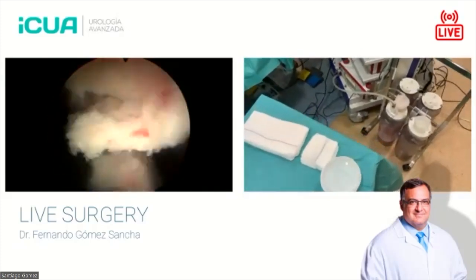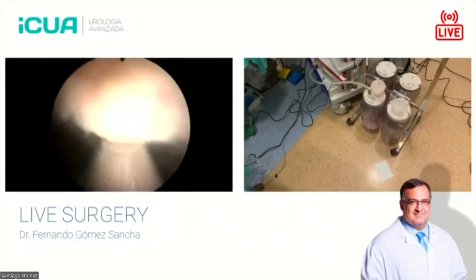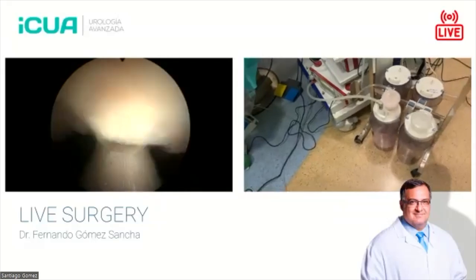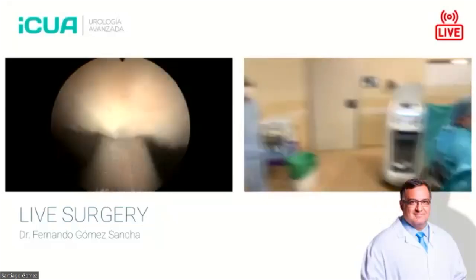What we do with them is we tell the patient that this is a relatively benign complication, and we do, under sedation, a Mercedes star incision and we inject triamcinolone in the incisions. And I have to say, with very good results. It's very unlikely that this will recur again.